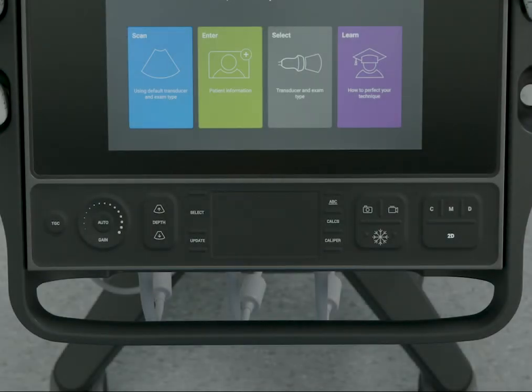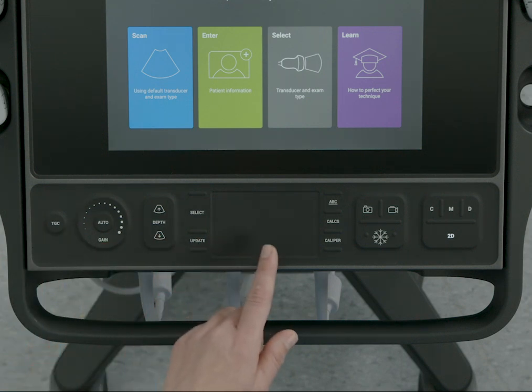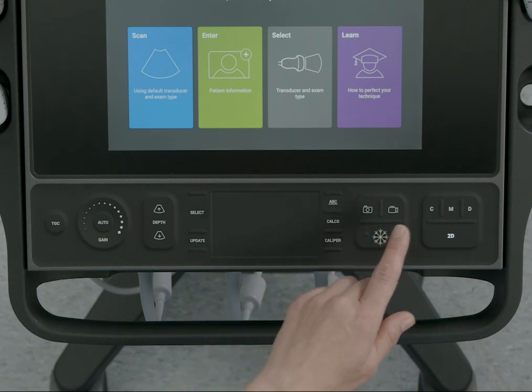The system has physical controls to adjust the image. These include gain and depth controls, a touchpad to control items on the clinical monitor, the ability to freeze and save images and clips, and imaging mode controls.